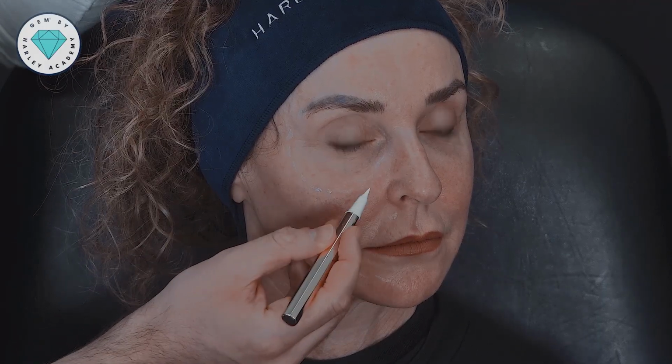There are things that we can do as injectors and things that we shouldn't do as injectors that assure us that our patients are unlikely to have filler migration or filler displacement over time. So I want to talk about three different factors, but before I do that, let's just see if you can see what I see from a lateral view.